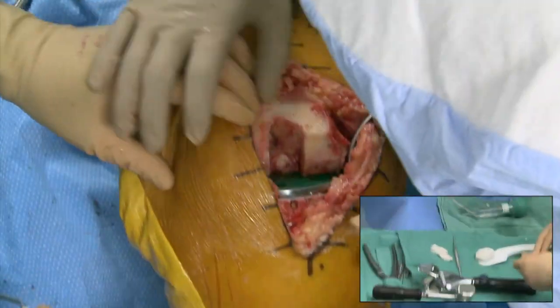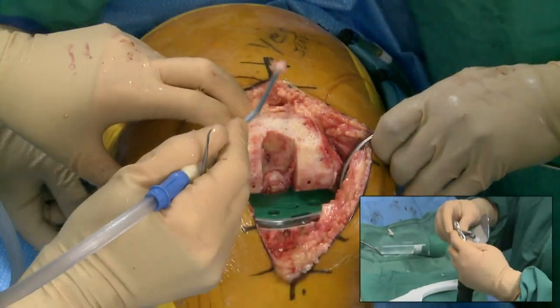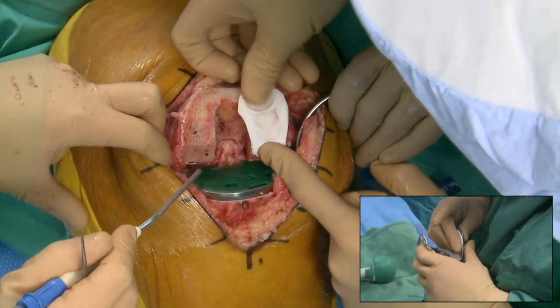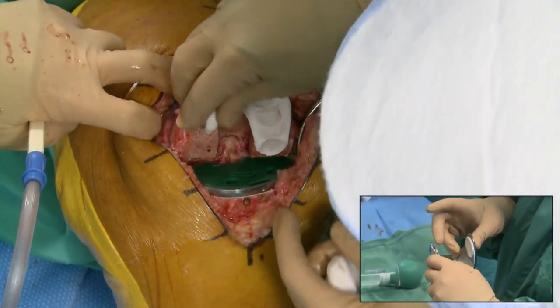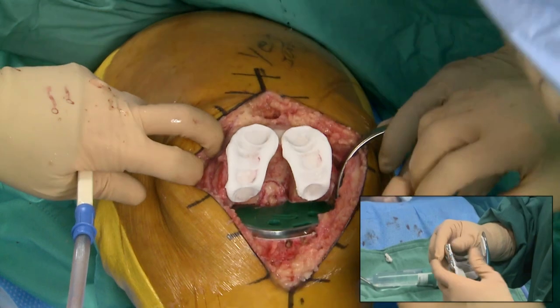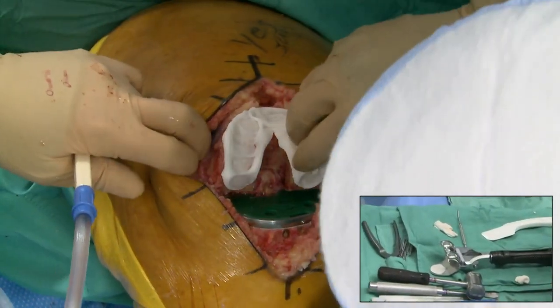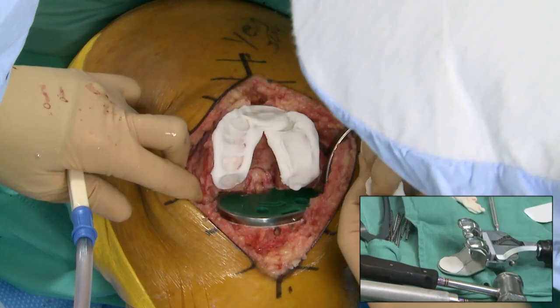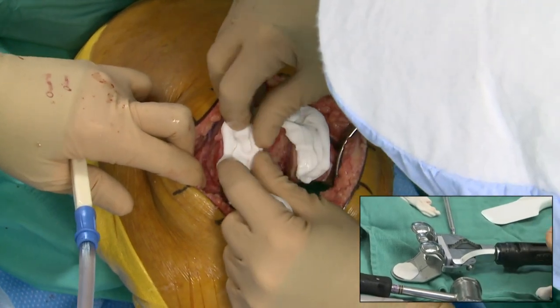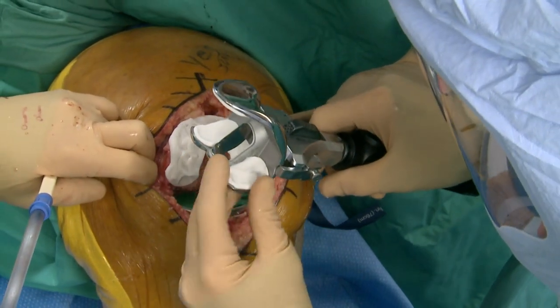You have to hit your marks on the timing. For the femoral side, same kind of thing — I want to get as much pressurization as I can along the surfaces. I put cement on the whole femur up to the posterior chamfer. I don't put it posteriorly because I don't want it pushed to the back where I can't retrieve it. Beth has put it on the posterior part of the component and posterior chamfers as well as anterior. I put it on in flexion first and then lift up to try to compress the cement posteriorly.